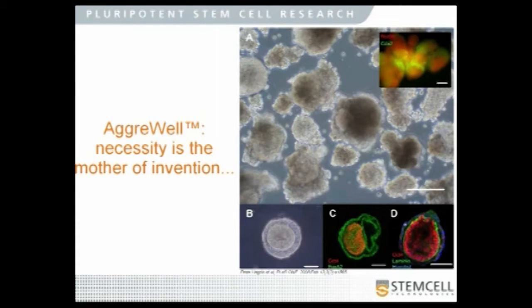And these sources of heterogeneity are quite significant in that it means that no two cells, whether within the same aggregate or in between aggregates, are likely to have the same local microenvironment. And that's significant because of the impact that the microenvironment can have on differentiation outcomes. So inset in the upper right corner here is an immunofluorescence image of some embryoid bodies that were fixed in the process of aggregating together.